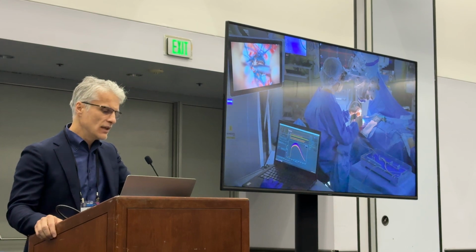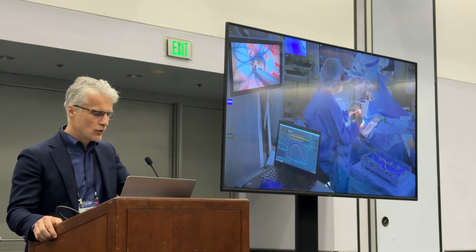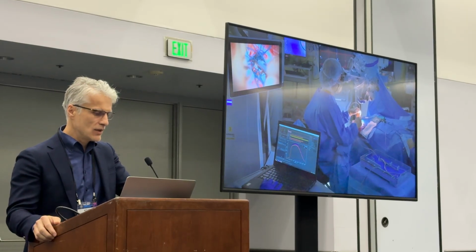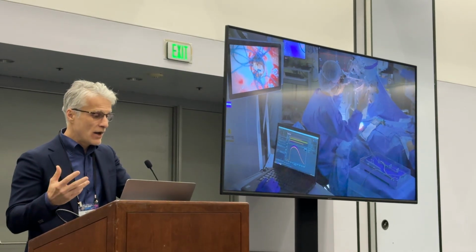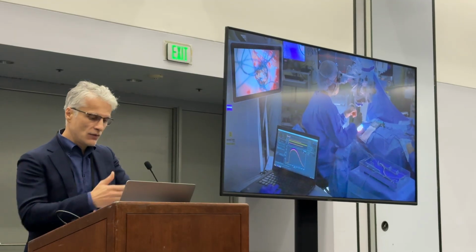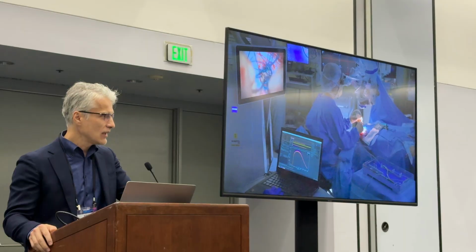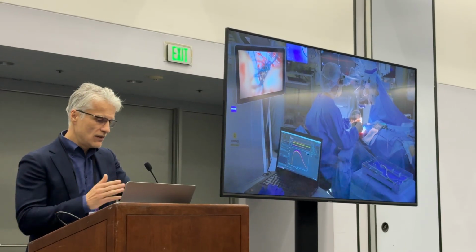So generally, it's pretty obvious in most cases to understand what bulk tumor is, but when you lose your certainty, you no longer have your navigation, at least with any accuracy during an operation, you become wary of continuing your surgery in super important territories. And so this device allows you to at least assist you in understanding what is that white tissue that you see in front of you. And so all of these are normal spectra.